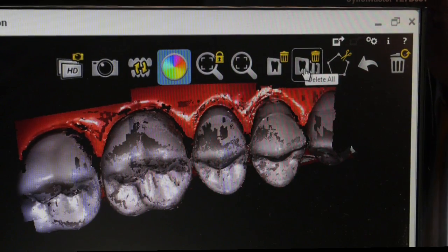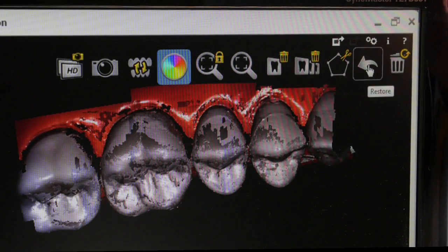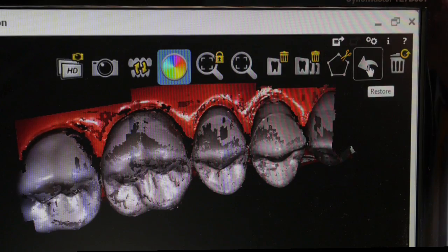If I delete everything and I get that wrong, go to this icon here and restore the last delete.